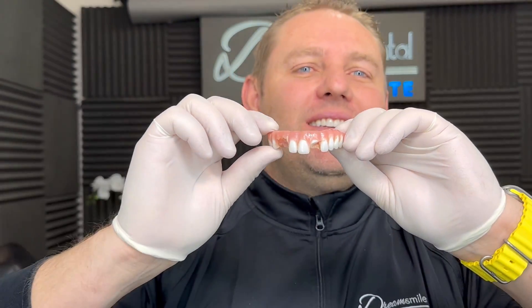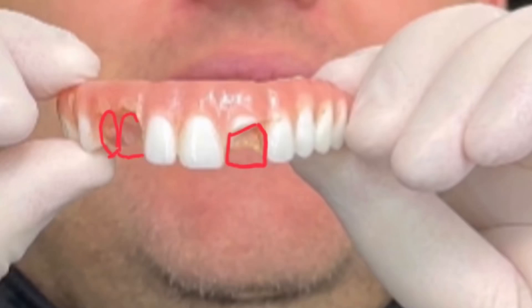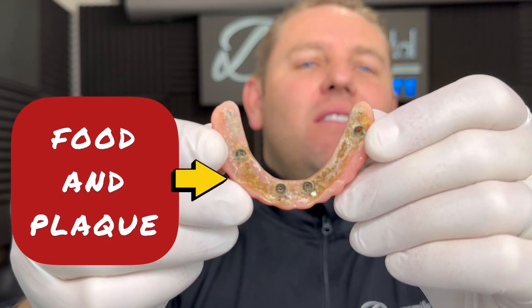Do we see this? Zoom in here. What in the heck is going on here? What is going on there? Look at the bottom. What's going on here?